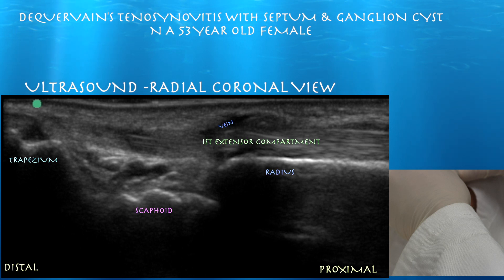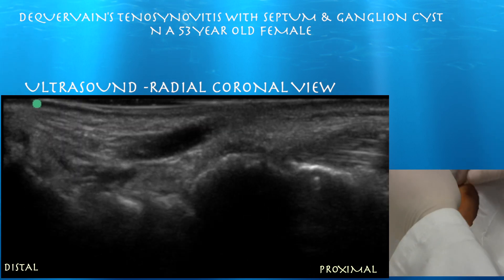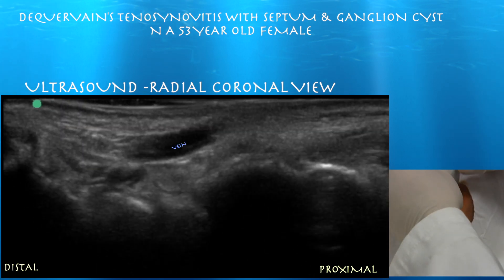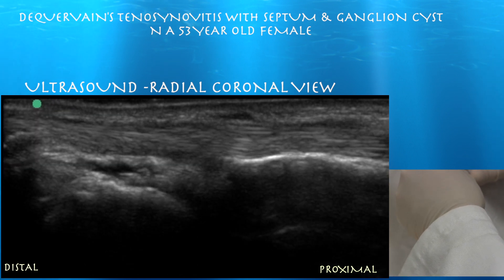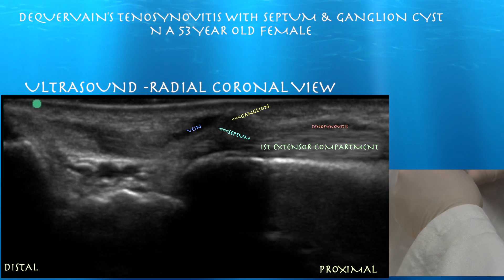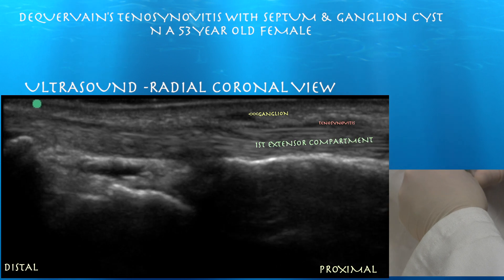Here you can see a vein right over the first extensor compartment. You may mistake it for a ganglion initially, but as you follow it distally you can see that it's a vein. As we toggle along we can make out the ganglion that is separated from the vein — you can see it right over the first extensor compartment. There's also a little bit of tenosynovitis within that first extensor compartment.